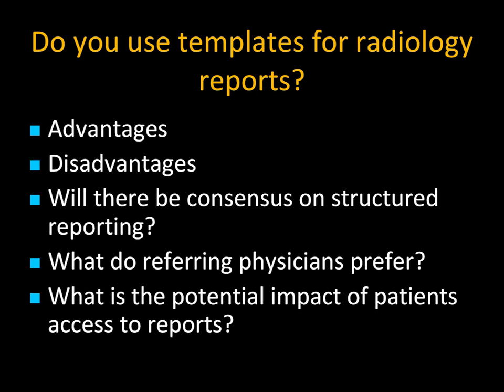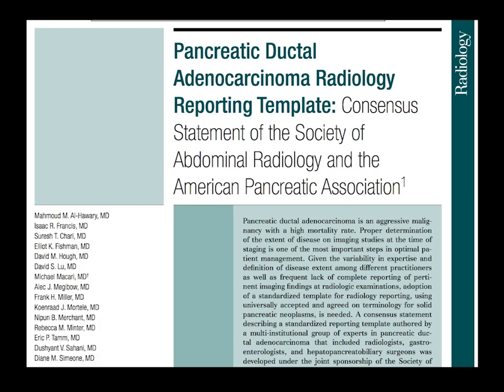Referring physicians, what they prefer is the correct report. They want the information they need, not a long story. Now, we do have some things with templates, like for billing, the patient was done with IV contrast, or done with oral. That's all great. To me, in terms of the report itself, beyond that, I like to be able to talk about what I'm seeing. And since I have reasonable experience, for example, in pancreas, I know what the surgeons want to know, and I'll make sure I cover each and every point.